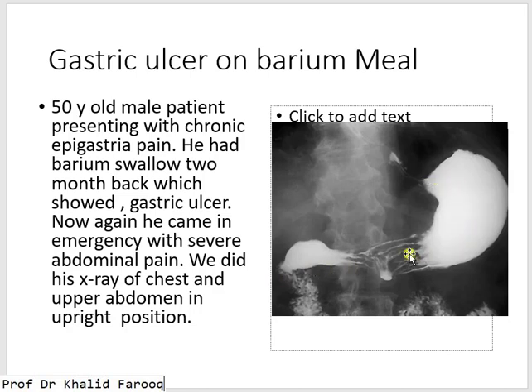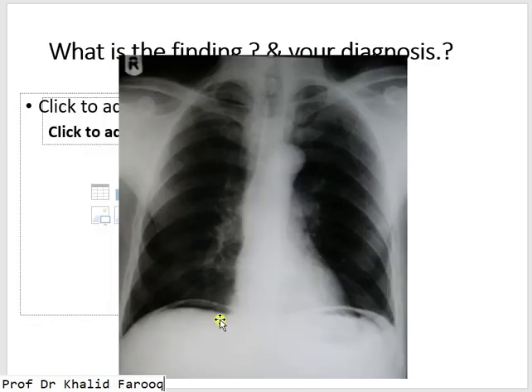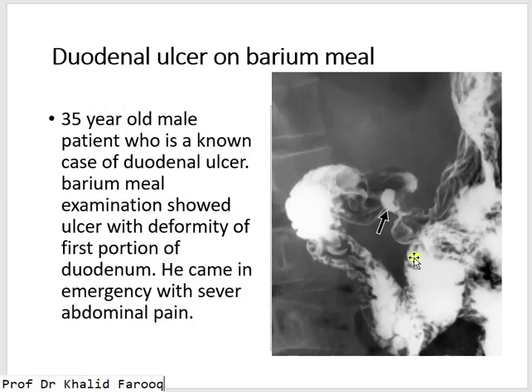Here we have a barium meal examination where contrast outlines the stomach and duodenum. This is the area where we can see an ulcer with radiating mucosal folds. This patient came with a history of acute pain, and on X-ray of the chest and upper abdomen we can see air under both hemidiaphragms, suggesting perforation.